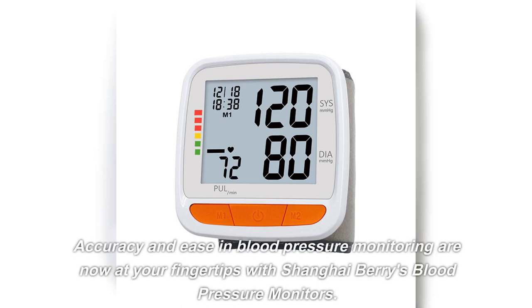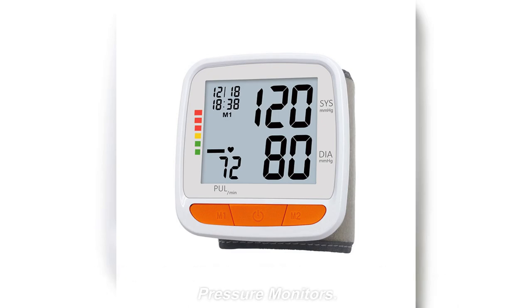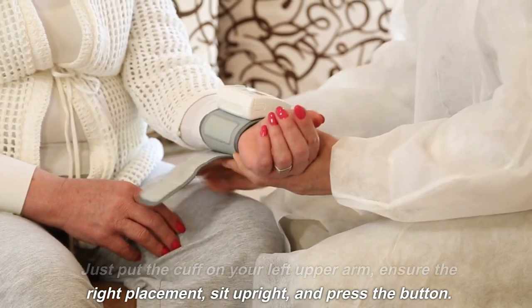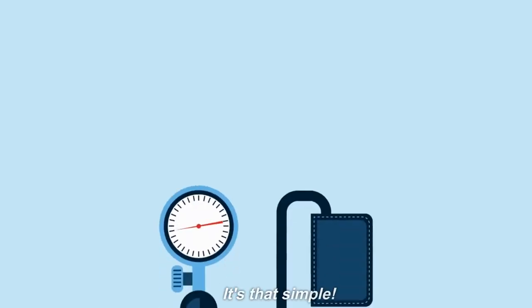Accuracy and ease in blood pressure monitoring are now at your fingertips with Shanghai Berry's blood pressure monitors. Just put the cuff on your left upper arm, ensure the right placement, sit upright, and press the button. It's that simple.